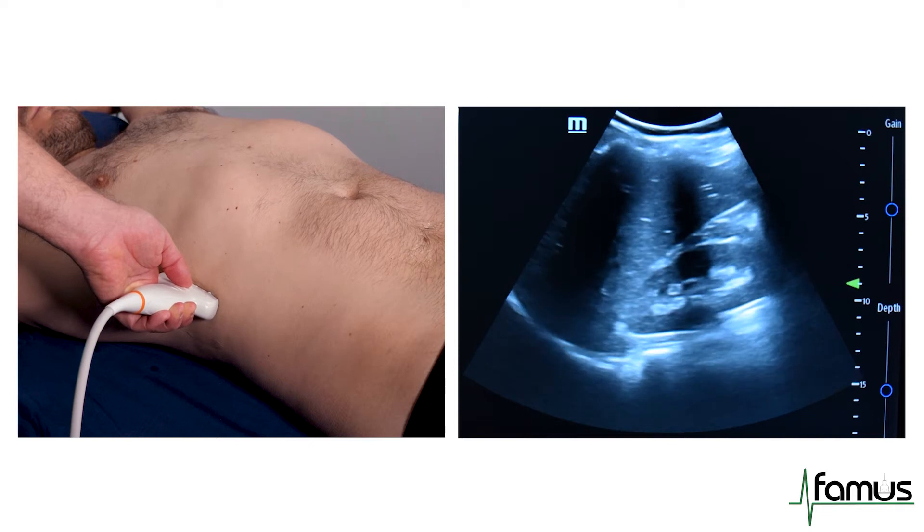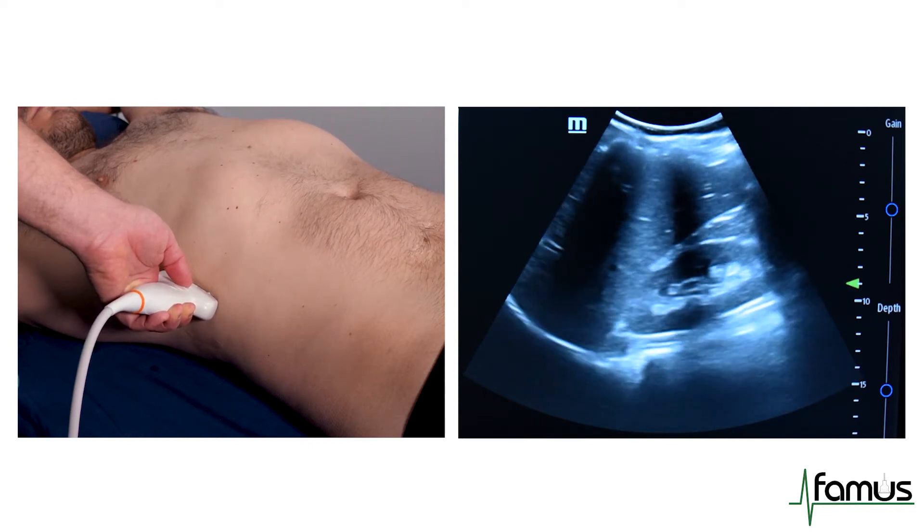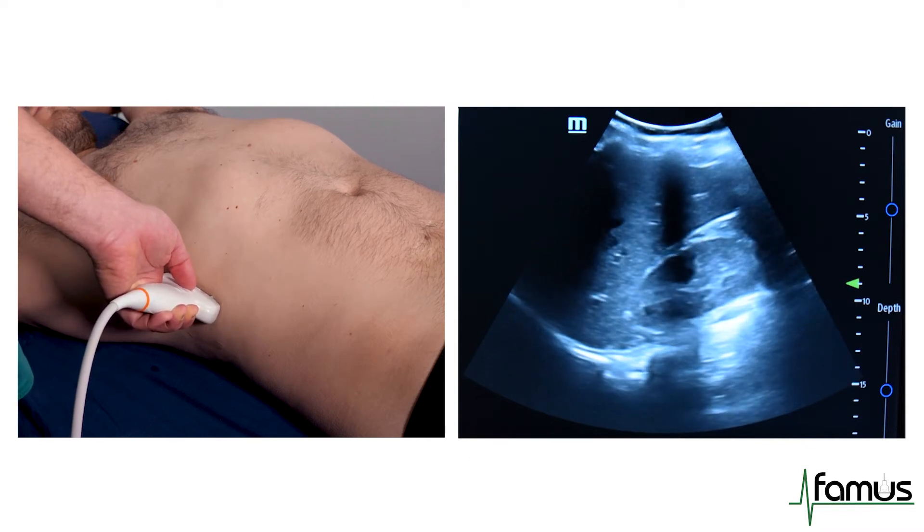On looking at the kidneys, we can see the bright kidney sinuses full of fat and the dark cortex of the kidney.